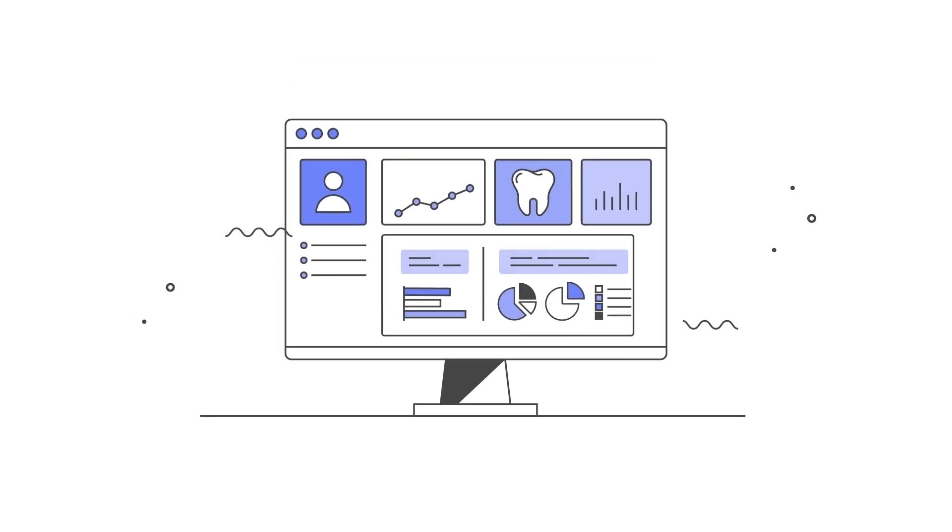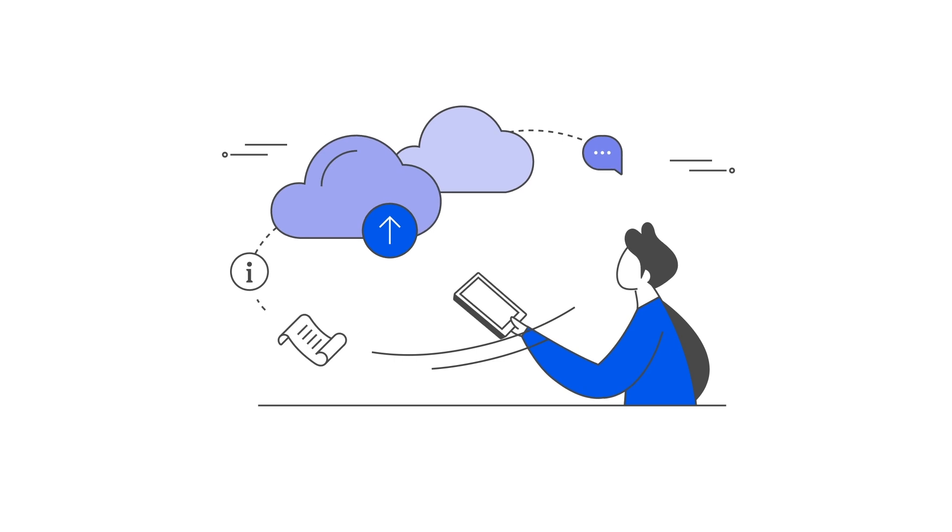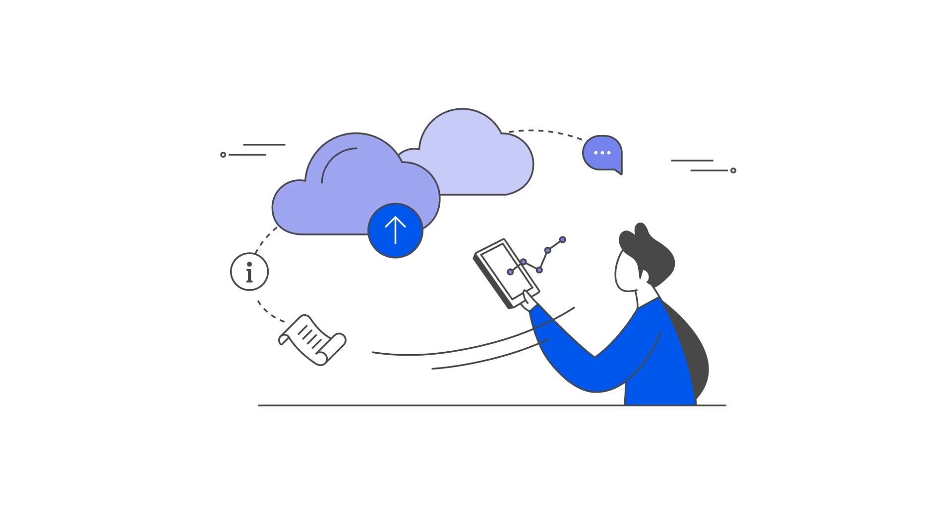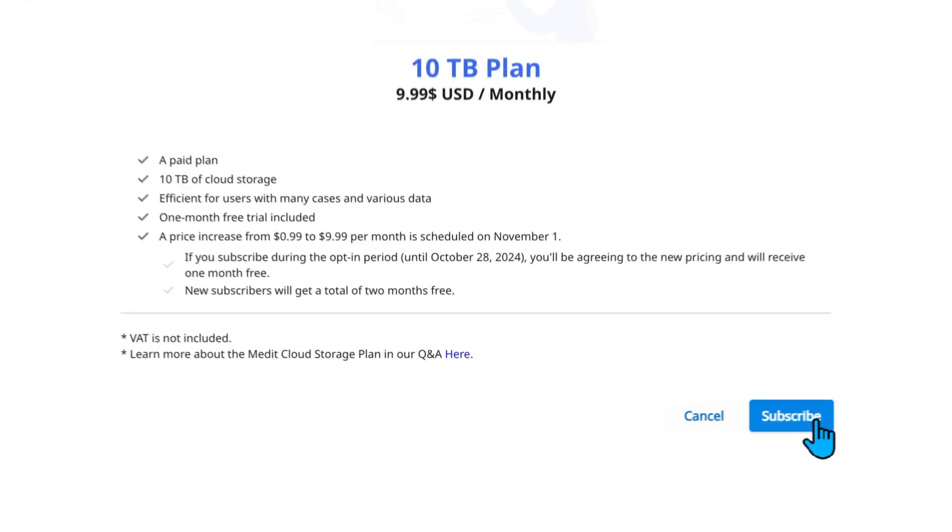If the cloud storage space is insufficient, you will be asked to either free up space or sign up for a cloud storage plan. We recommend getting a cloud storage plan as it is the easiest way to increase your cloud storage capacity.